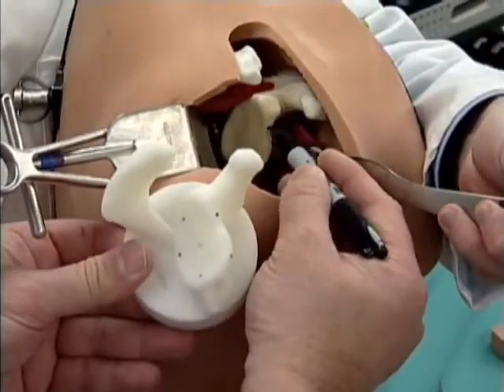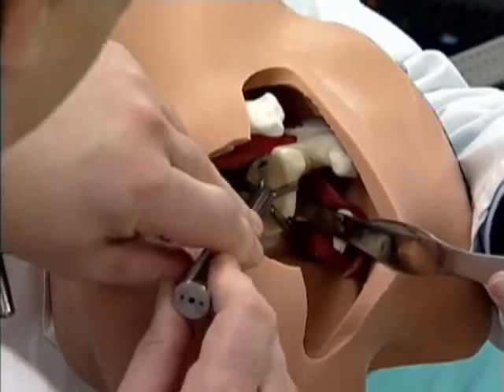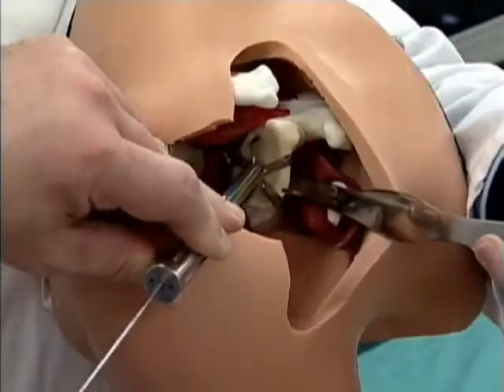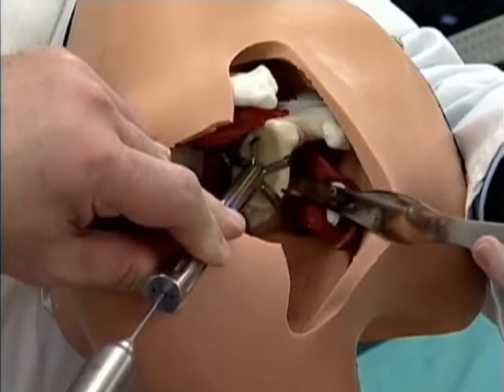The patient bone is then marked the same as the model and the guide pin is then placed into the glenoid bone.